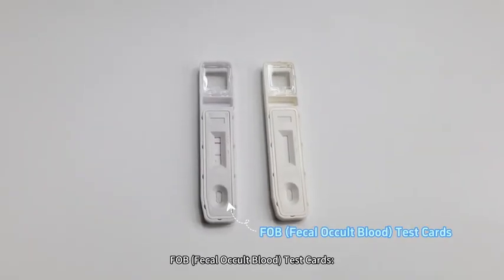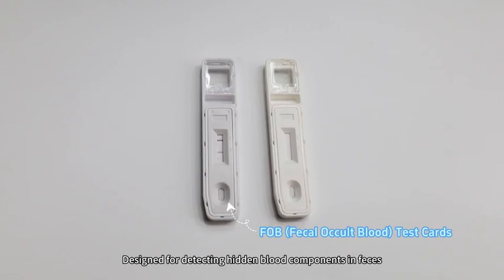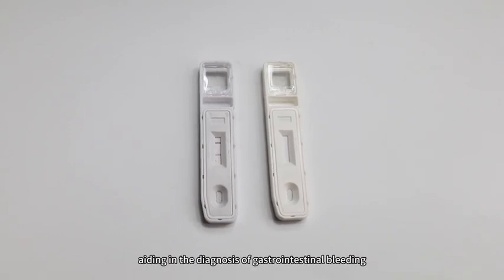FOB (Fecal Occult Blood) Test Cards are designed for detecting hidden blood components in feces, aiding in the diagnosis of gastrointestinal bleeding.